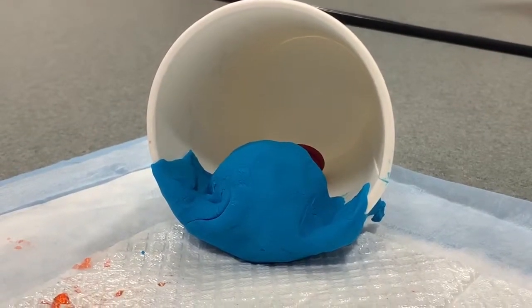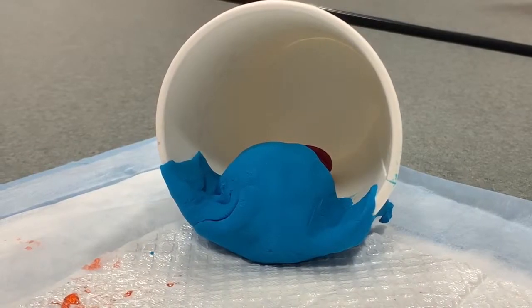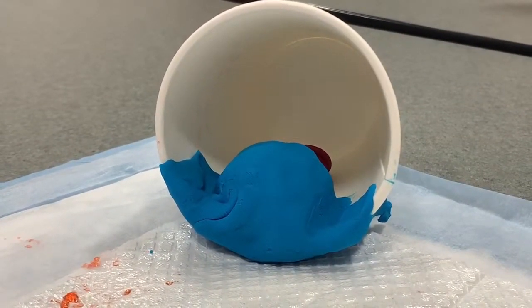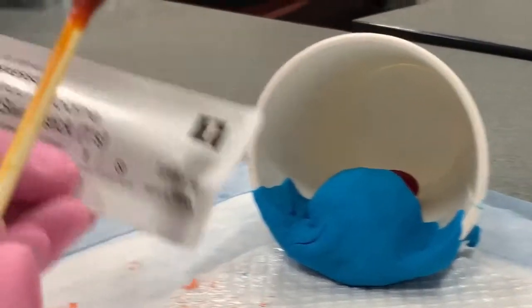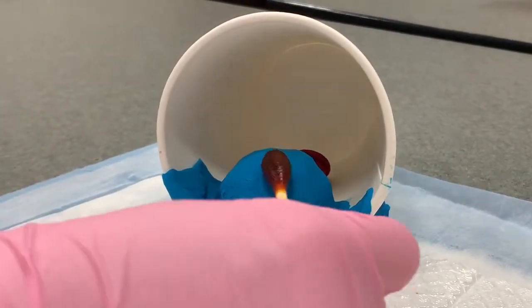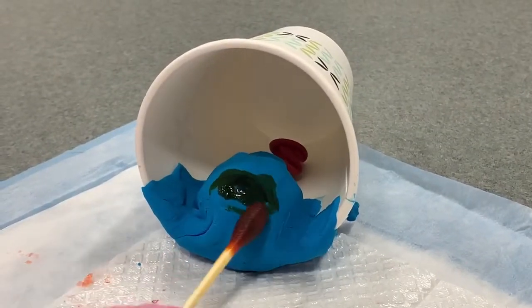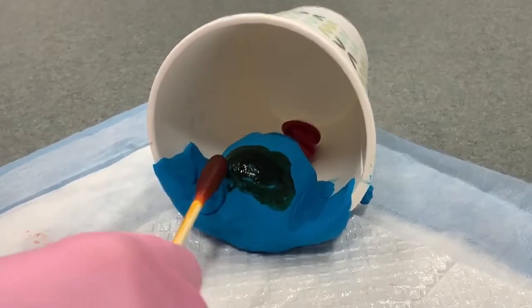Now we're going to review the steps on how to treat Bartholin cysts and cyst abscesses using a Word catheter. First, you prep the area with iodine swabs to sterilize your site and clean where you are going to make the incision. Generally, we use about 3 swabs to sufficiently clean the area.